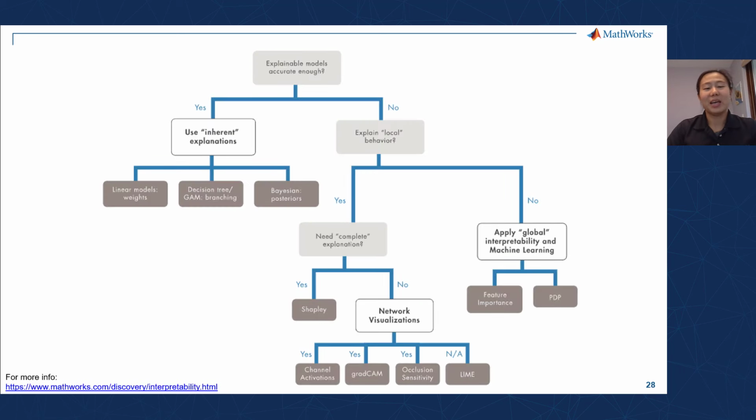All right. And the unfortunate fact of the matter is that we don't really have the best set of recommendations right now. There's not really an industry standard, but we do have a collection of options that you can choose from, and a few basic choosing heuristics that you can use. And so I definitely encourage you to check out our article on interpretability for machine learning and AI models. It's a really good read, and it's a really good introduction to some of the options that are available. It's really important to keep in your back pocket.